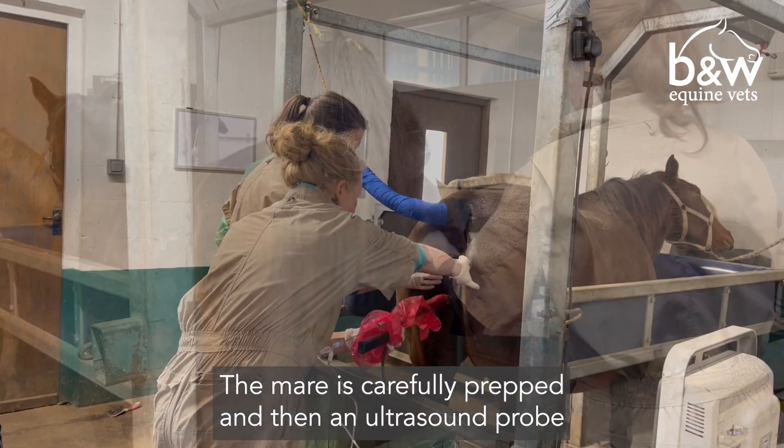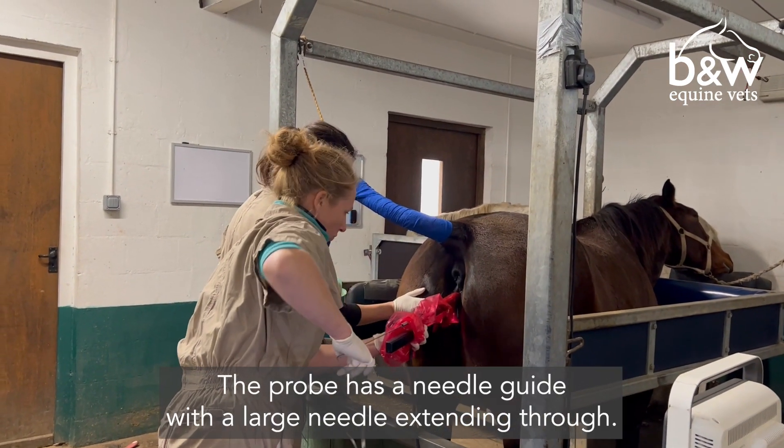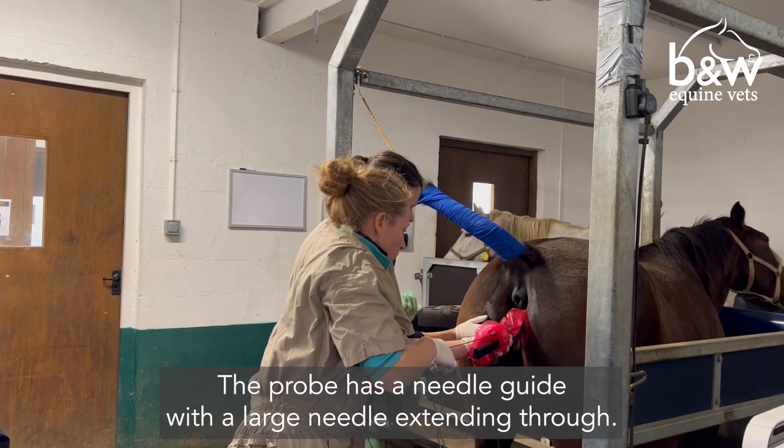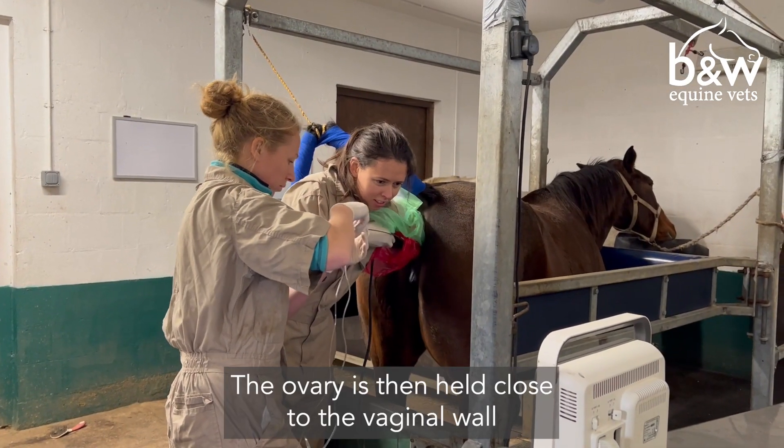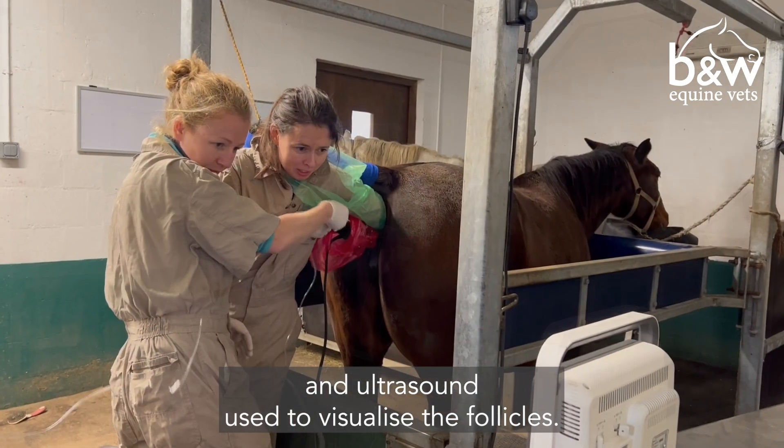The mare is carefully prepped and then an ultrasound probe is placed into the vagina. The probe has a needle guide with a large needle extending through. The ovary is then held close to the vaginal wall and ultrasound is used to visualise the follicles.